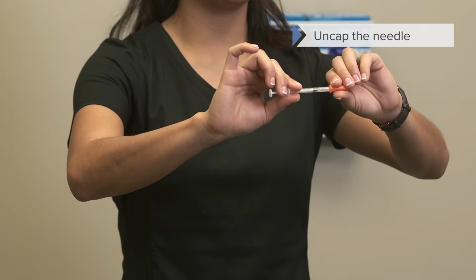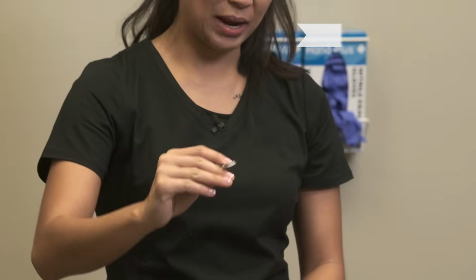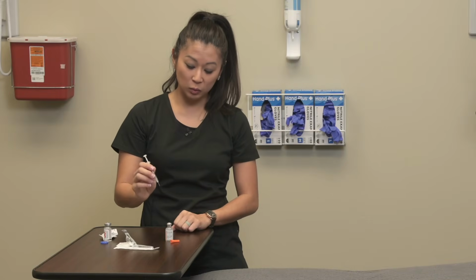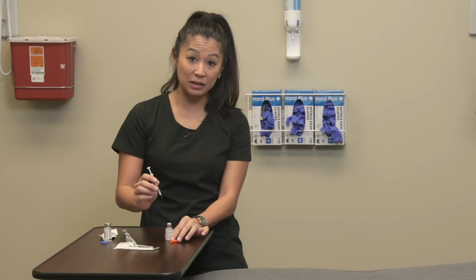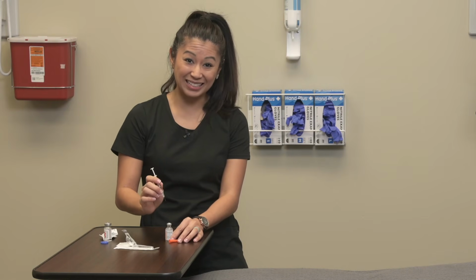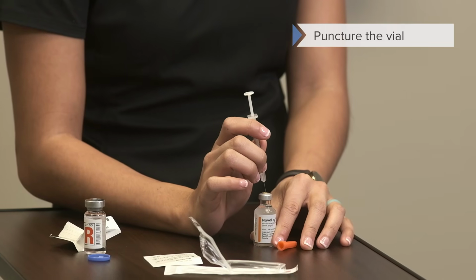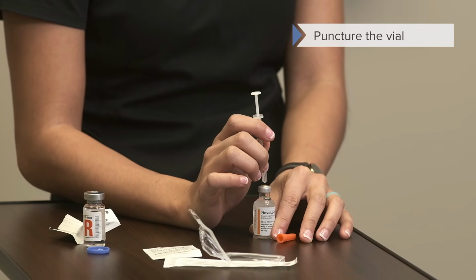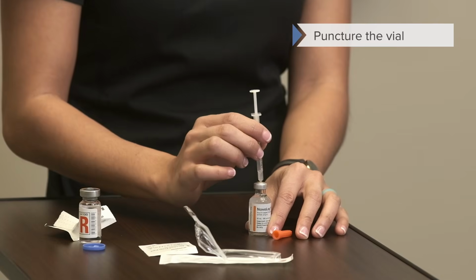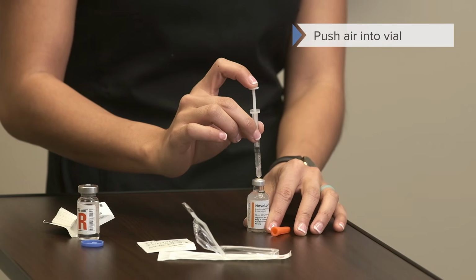So let's uncap the needle. I've got my air pulled back. And notice when I do this, I'm going to try to steady my hand and be very conscious of not accidentally sticking myself and sticking the vial. I like to rest my hand like this just so I'm very careful. So I put the needle all the way in the vial. Then you see me push the air into the vial.